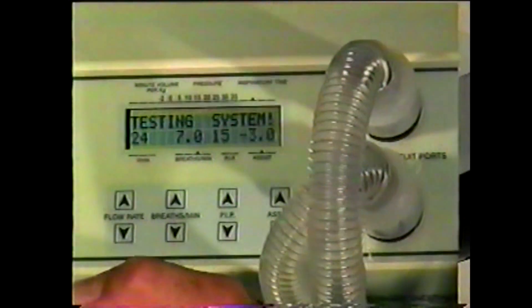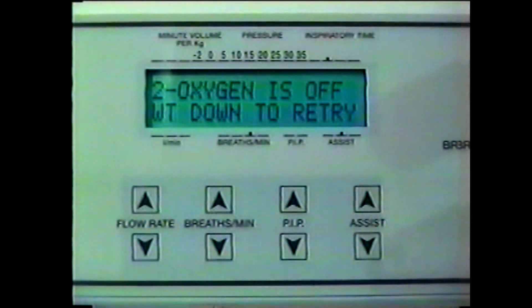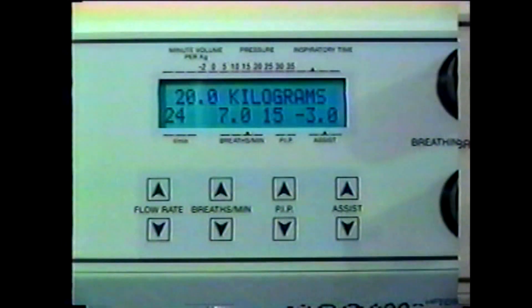The ADS will run a complete self-diagnostic test. If successful, the display will read 20 kilograms. If unsuccessful, follow the instructions on the display. You are now ready to use the ADS-1000.